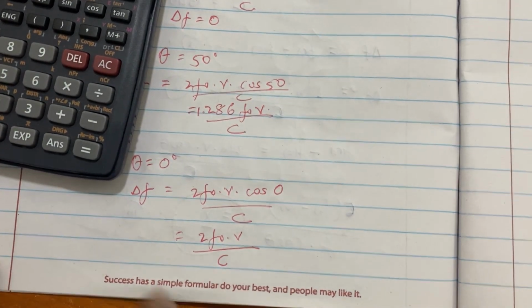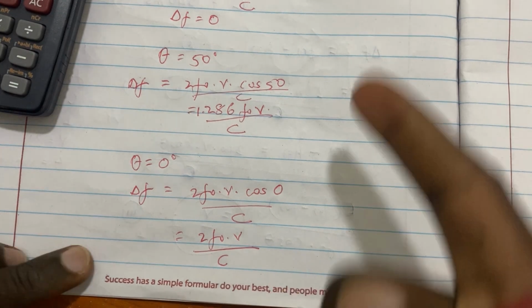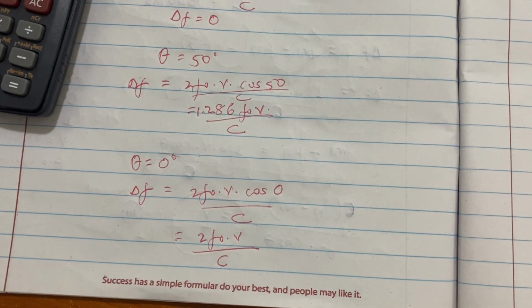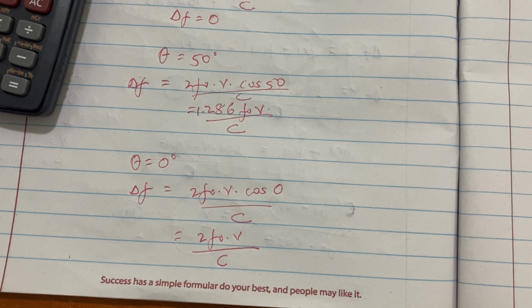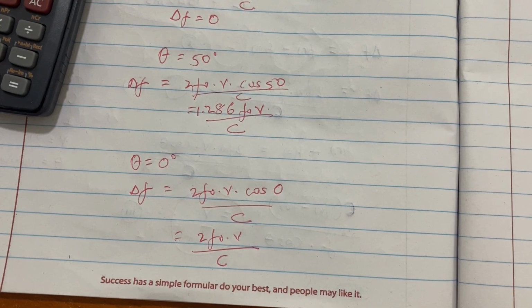So the Doppler shift will be greatest when theta is 0, and it will be 0 when theta is 90 degrees. That's why, when you remember in the other videos I posted, I was telling you we try to be as parallel as possible when we are using Doppler.